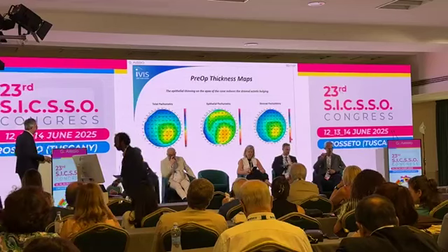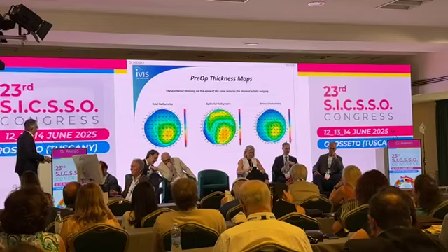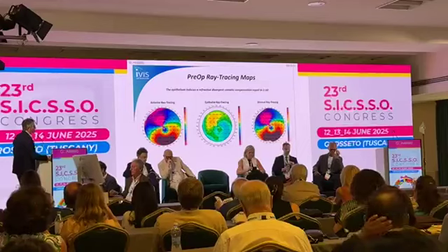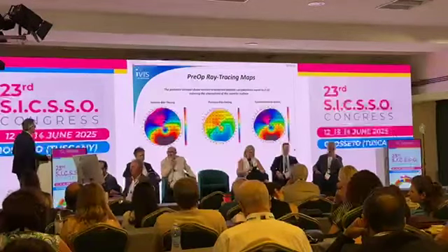The epithelial thinning, we know that at the apex of the cone it is thinner than in the other areas, can reduce the stromal ectatic bulging. With the ray tracing map, we can really calculate the possible compensation of the distribution of the epithelium that can correct aberration. With the ray tracing technique we can measure. In this case, the compensation is equal to 2.1 diopter.